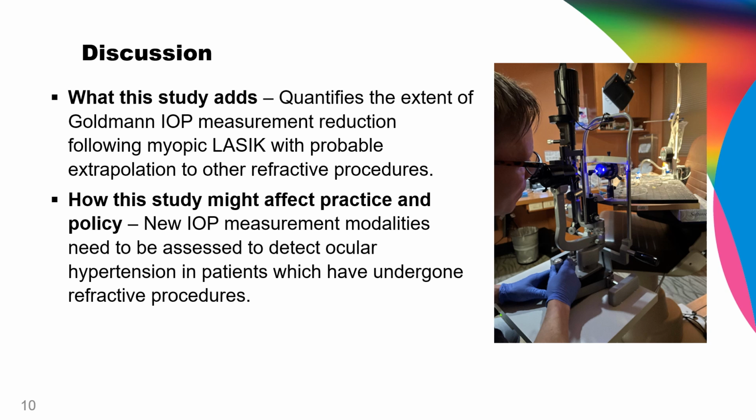The intracameral comparison and clinical validation quantifies the extent of Goldmann IOP reduction following myopic LASIK, which can be extrapolated to other refractive procedures. New IOP measurement modalities need to be assessed to detect ocular hypertension in patients who have undergone corneal refractive procedures.